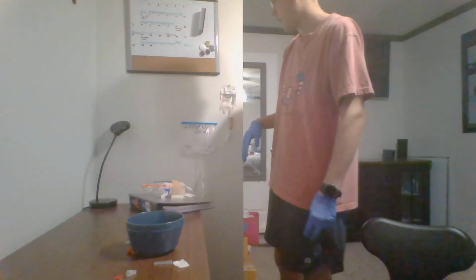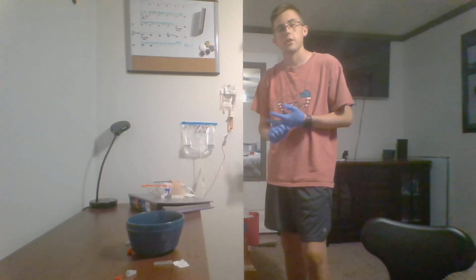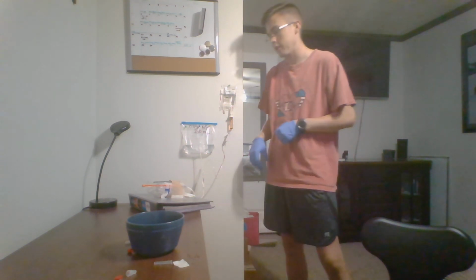Then after I have everything all together, I will then monitor my patient for any adverse reactions, any other undesired side effects, or any other irritations to the IV placement.